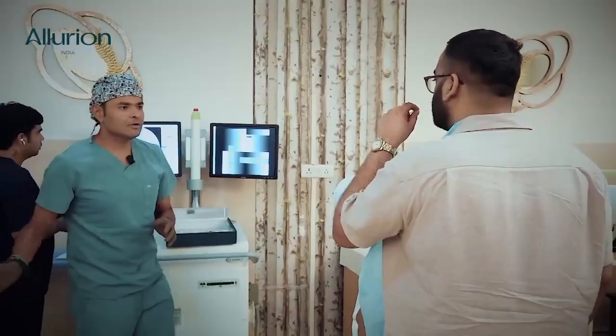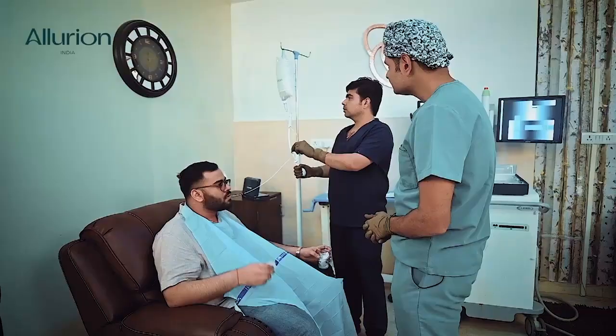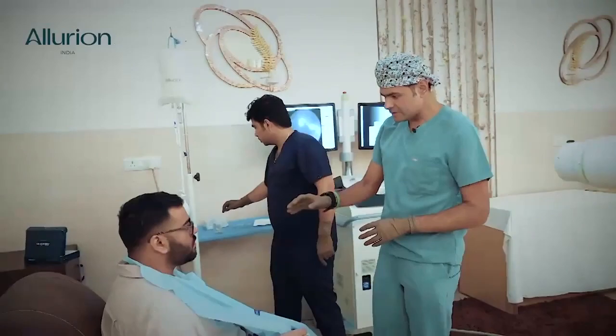Now you can come and we'll initiate the filling. We will start the filling — we are using 300 millimeters of HG pressure to fill it. Now you can see that this particular balloon is completely full, and there is a little amount of air which you see here — that's the air of the balloon.